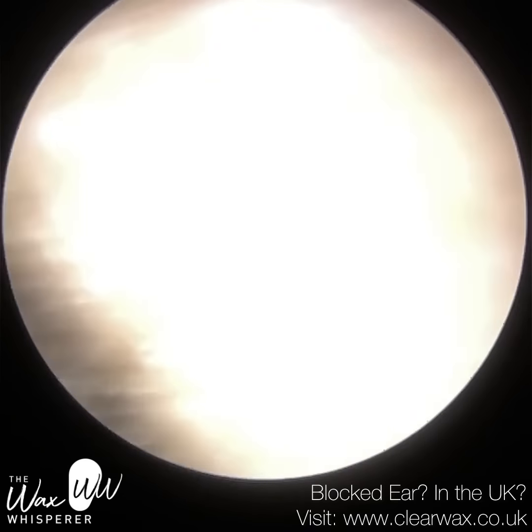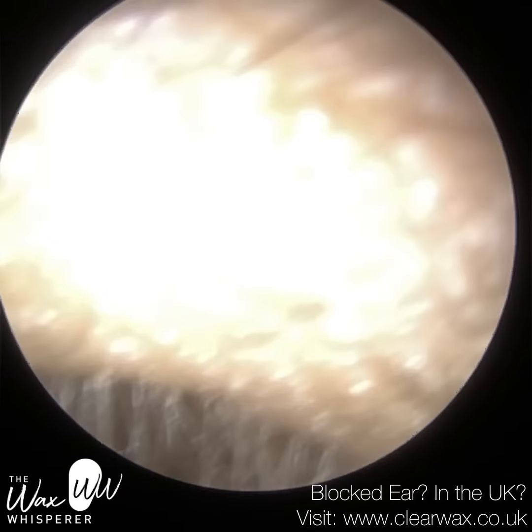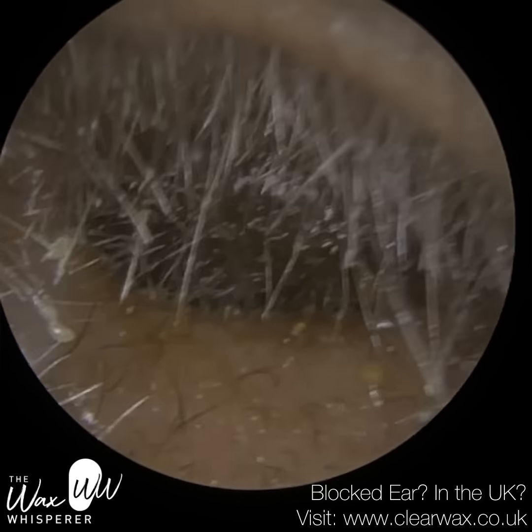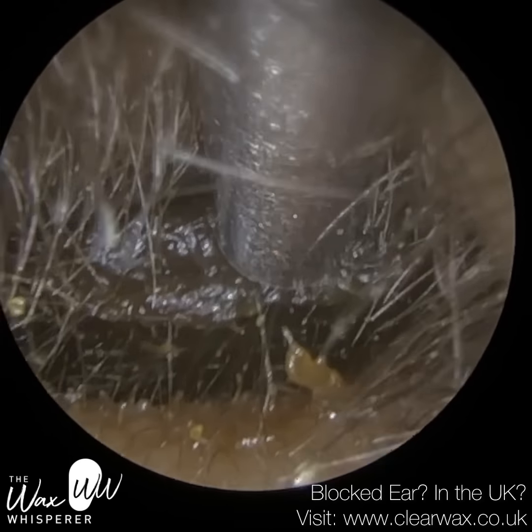Hi everyone, this is Neel Raithatha, also known as The Wax Whisperer. Thank you for joining me in my latest video. I have here a patient who attended with bilateral fully occlusive earwax and I'm commencing with their left ear first.